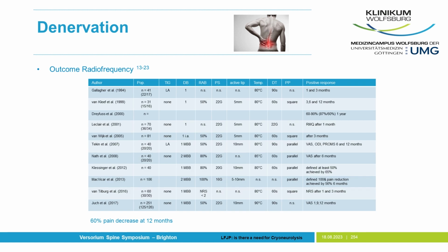For the radiofrequency, it's very important to do it parallel to the target nerve. For the cryo, it's not essential. The probe lesion by the cryo is circumferential, by the radiofrequency transverse. The tip lesion is big by the cryo and little by the RF.